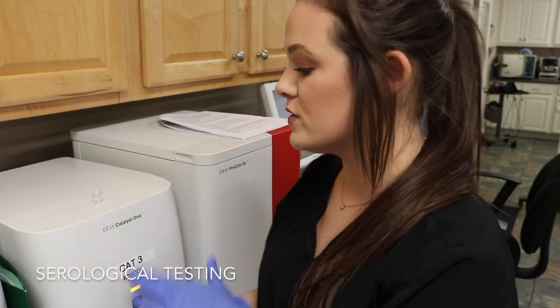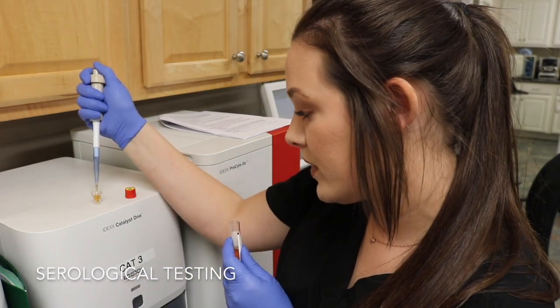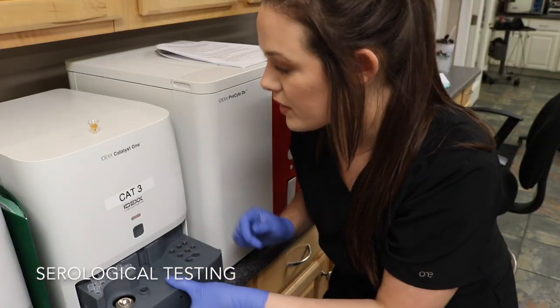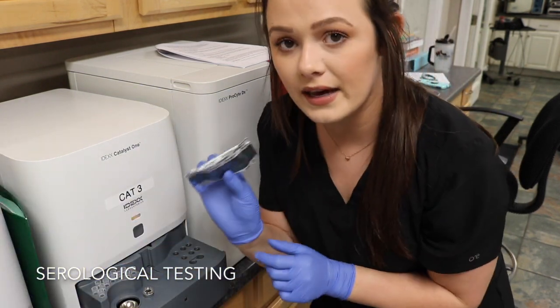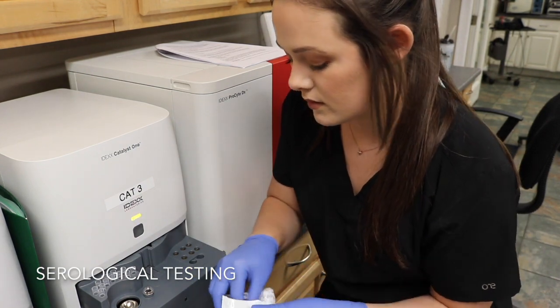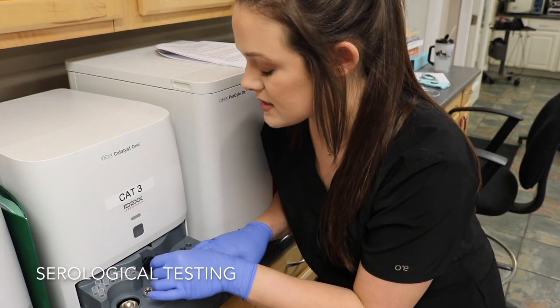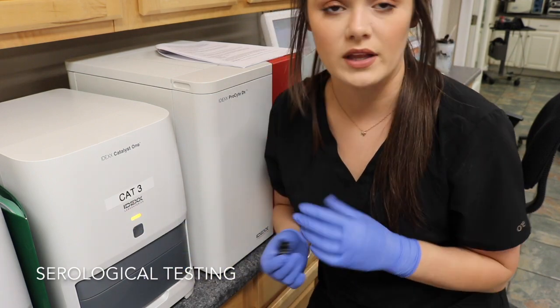For my serological testing I'm going to be using our Catalyst on this particular patient — my doctor just wants electrolytes run on him. I'm going to take a serum sample and fill the sample cup with the required amount of serum. To run a blood chemistry on this machine, I open up the drawer, place my sample in the sample container, take my electrolytes slides, place the slides in, push it in, and press the button — that's going to run my electrolyte test.